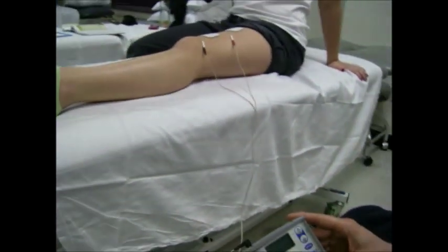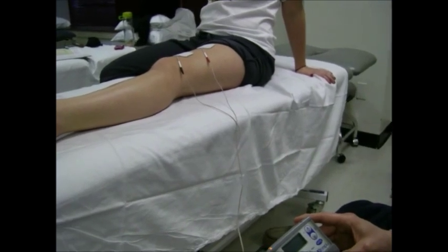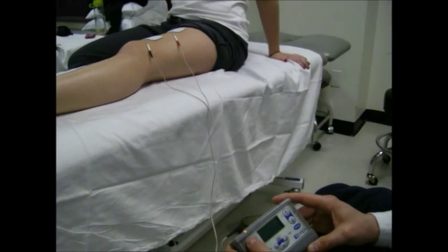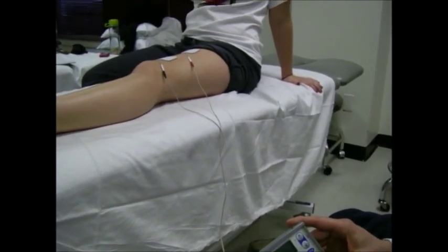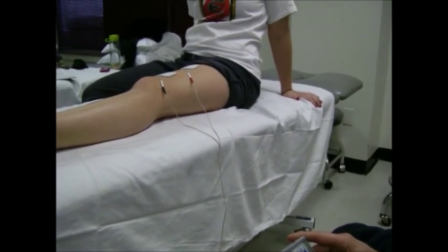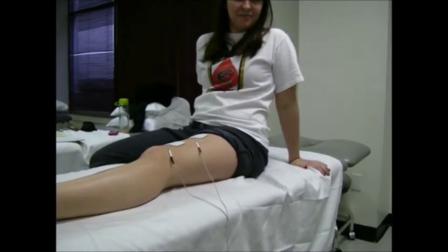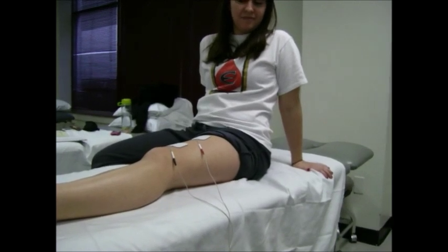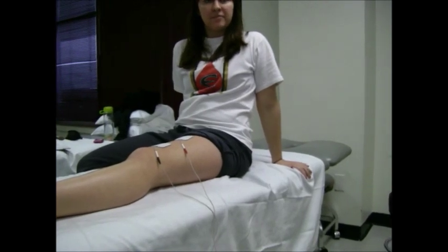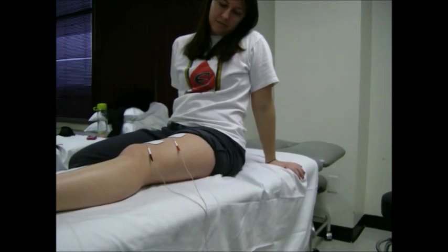We are going to begin our treatment now. We are increasing the intensity to first elicit a comfortable contraction. How does that feel ma'am? I am just kind of tingling. I don't see any twitching. Our session began with 10 repetitions at a comfortable stimulus amplitude, which we are currently doing.